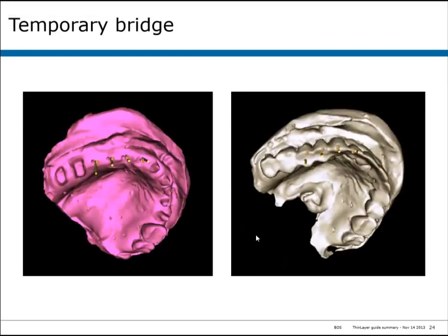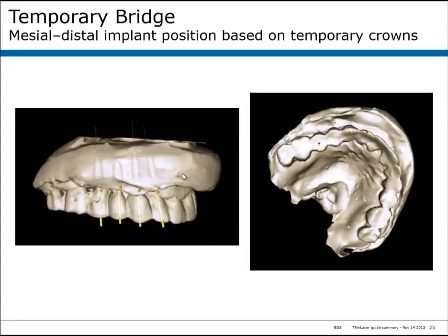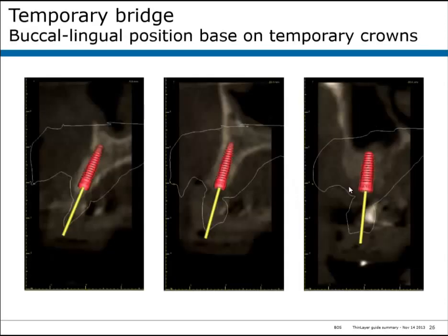The next case involves using a temporary bridge to discern future tooth position. This case was planned with two alginates — one of the patient without their prosthesis and one with the temporary bridge in place. In the software, the model was made translucent and the implants were each placed down the center of the tooth, adjusted buccal-lingually to be in optimal position at central fossa and incisal edges. In the cross-sectional views, the surgical envelope and the prosthetic envelope are visible in the same image, making it simple to place the implant in the ideal position. The bone cooperated and implants were placed within the surgical envelope in ideal prosthetic positions for the lateral, cuspid, and bicuspid.